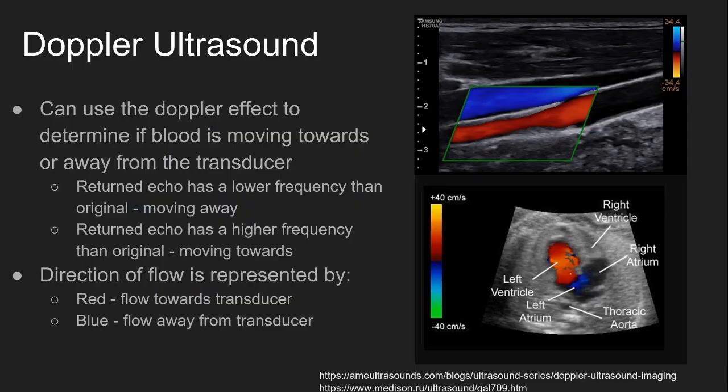Go ahead and click on this link. Here's an example of a video of transthoracic echocardiogram, or TTE, which uses ultrasound technology. Notice that the sonographer images the heart in both the longitudinal and transverse plane. Ultrasound has the advantage of being a real-time imaging modality, so you can actually see the heart beating and the valves opening and closing as it happens.